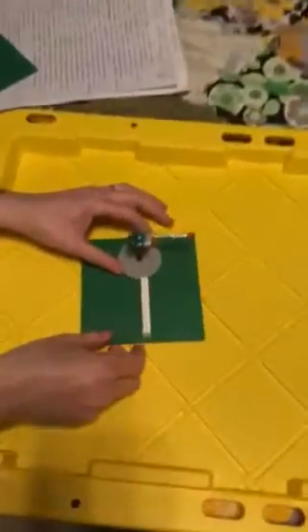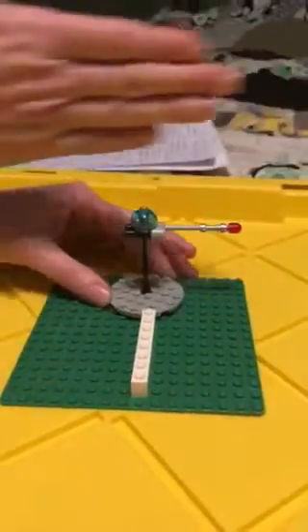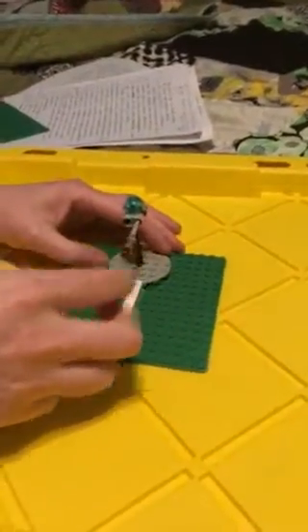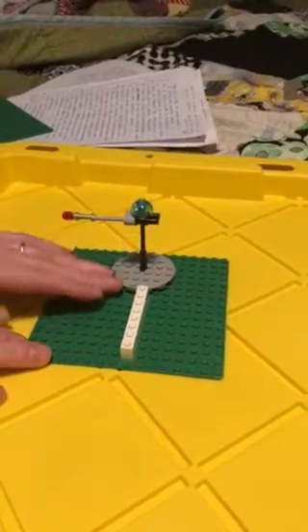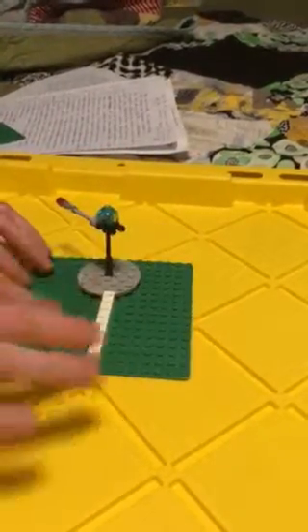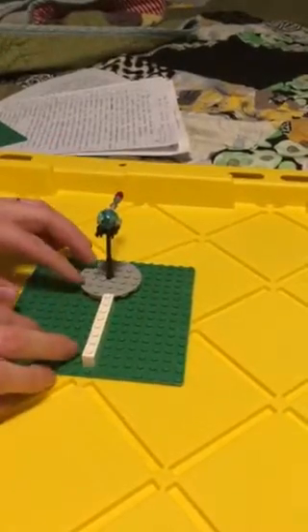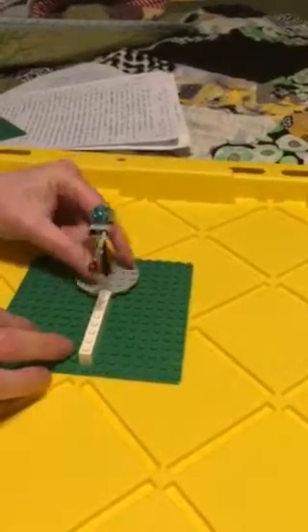So I have a small demonstration of when you have it applied. Here you have this aligned along the transverse magnetization, and then you apply a gradient and it knocks it this way. You apply a gradient, it knocks it this way. You apply a gradient, it knocks it this way. When it's trying to get back to those places, there's that residual transverse magnetization, and those gradients just knock it out of the way to be able to get a fresh signal when it changes its pulse direction.